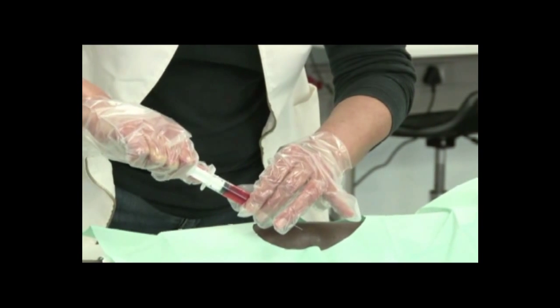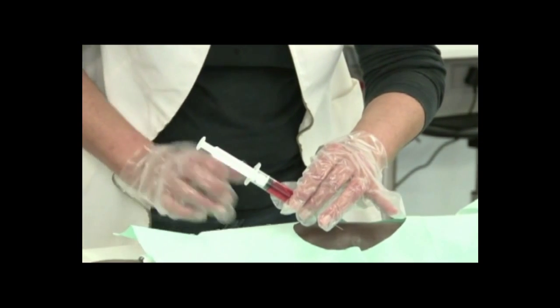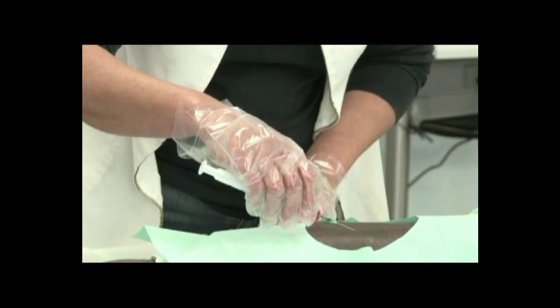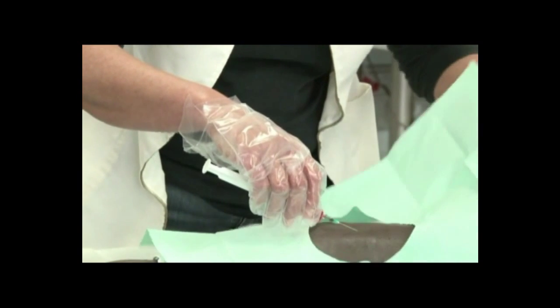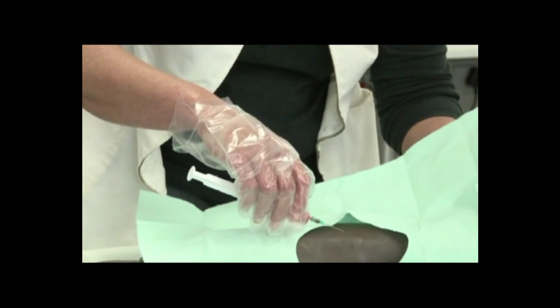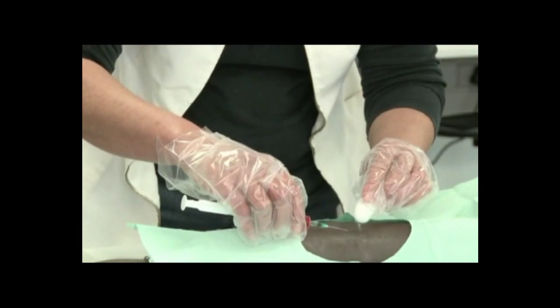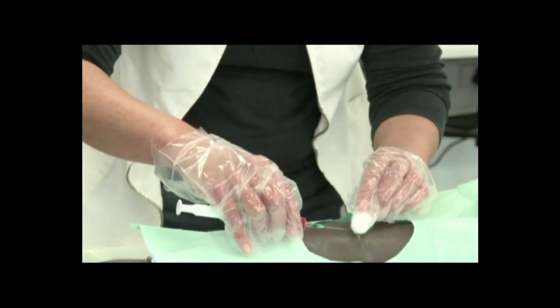Once you have collected your blood, make sure that you hold the needle and syringe in position. Release the tourniquet. And upon removing the needle, place a swab over the injection site and apply pressure.